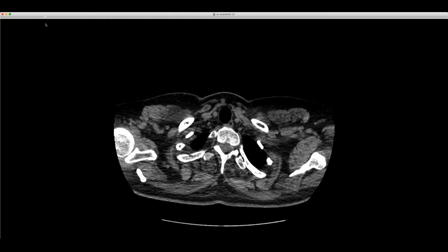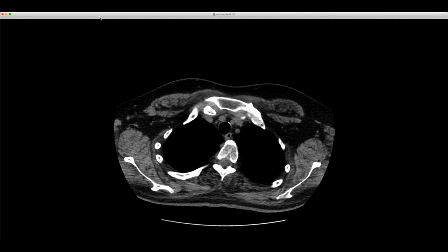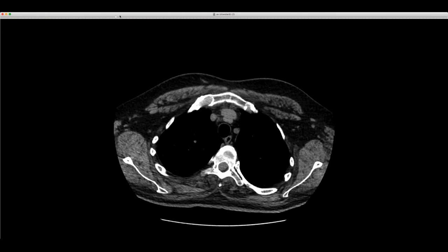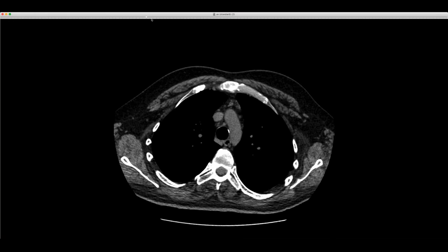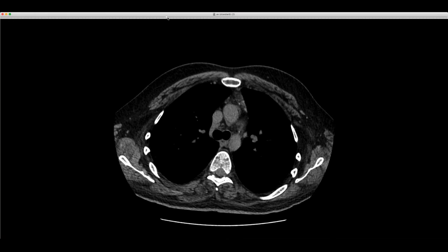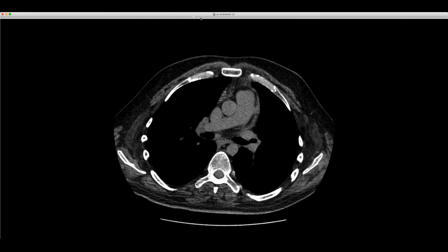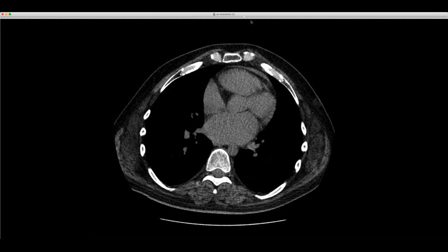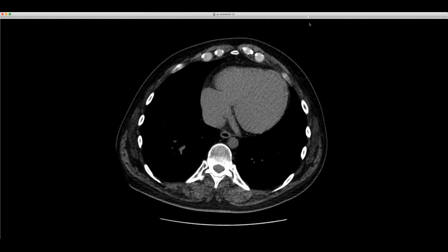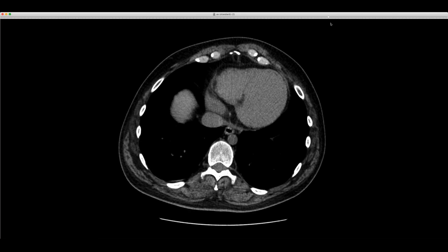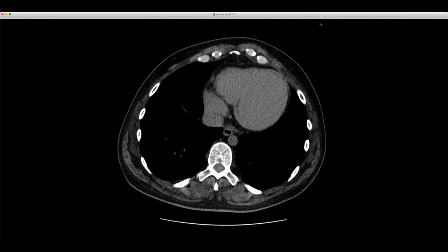This is a 35-year-old man, and this just came across the desk again today. We're looking at the heart, and even for this non-contrast study, you can see that it's abnormal.